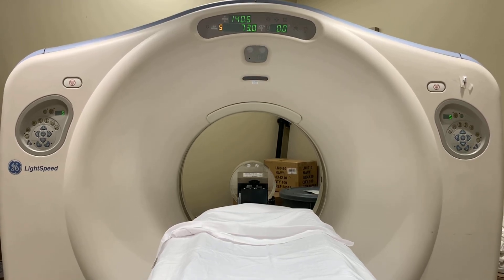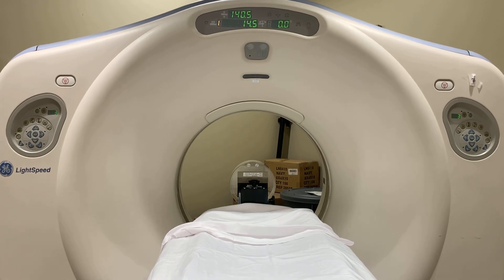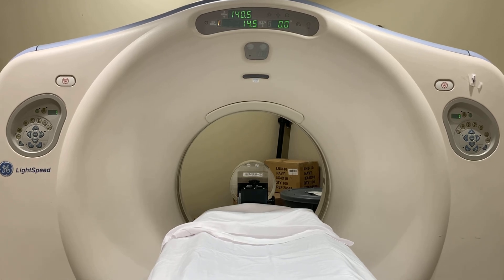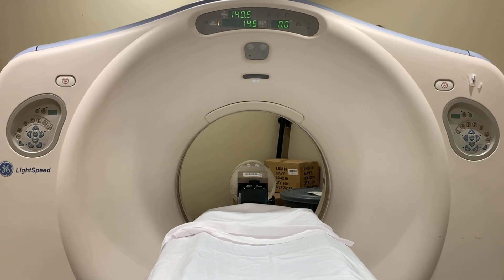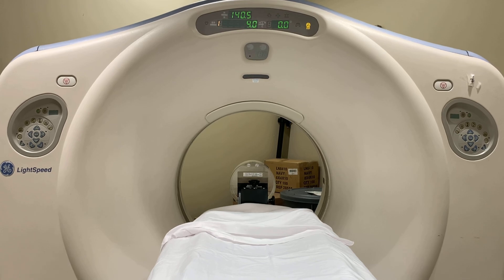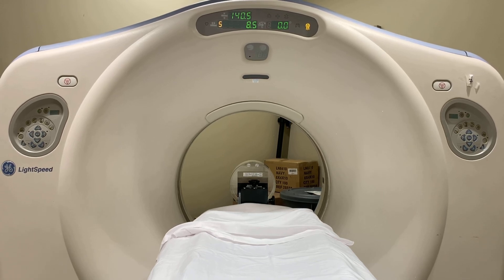The first scan series is always a low-dose scout scan. This scout scan, or localizer scan, provides a reference for the CT technologist to set up the scan protocol.